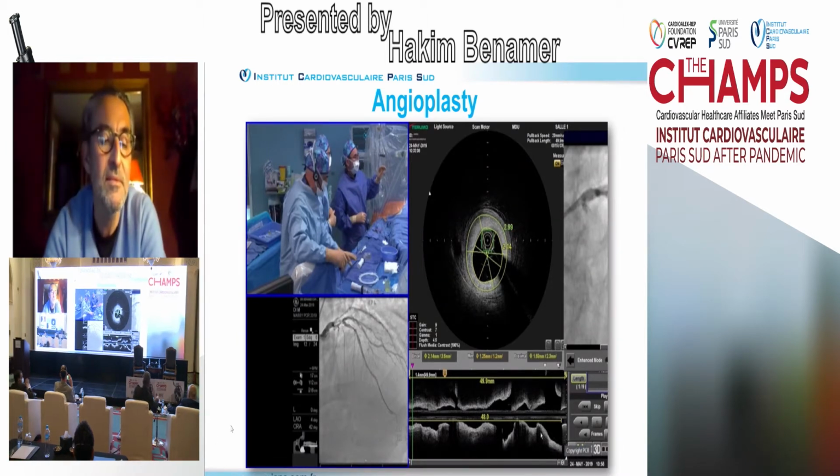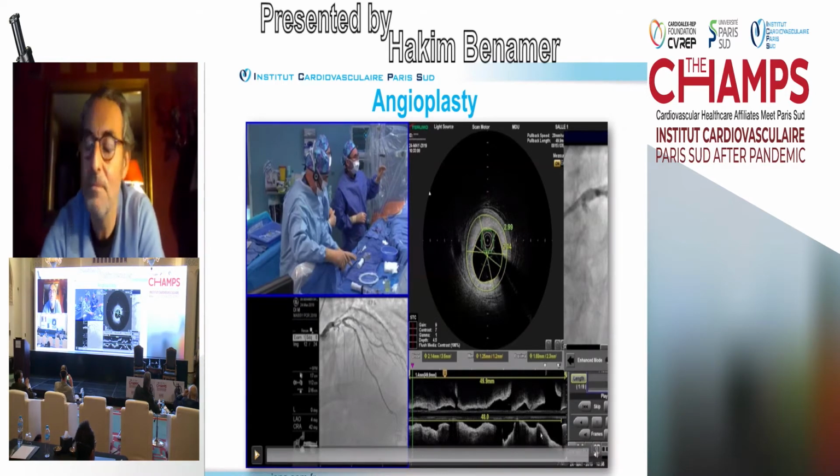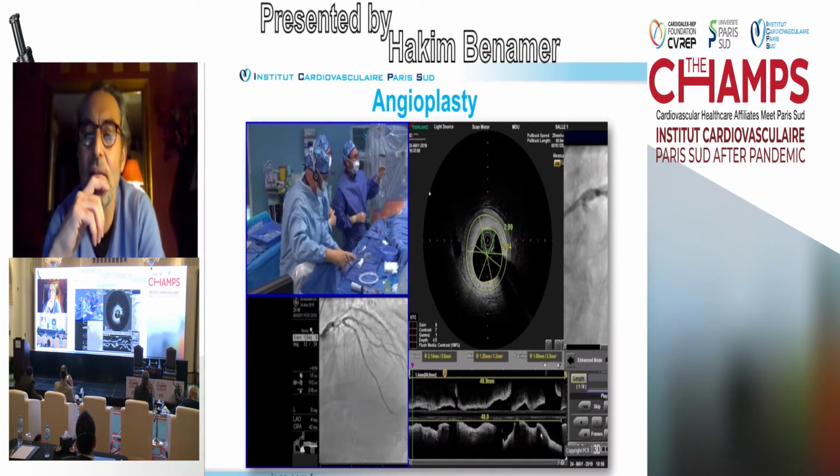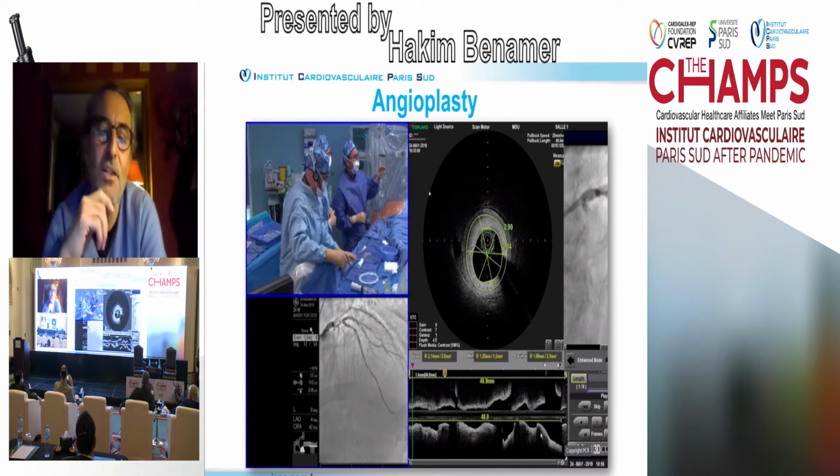Yeah, but you can't put the stent and adjust it to the ostium. You will cross over, of course. No, by Zabo technique, you can adjust only one strut in the left main. It will be sufficient for this lesion. So Dr. Khaled Chokri is suggesting spot stenting rather than crossover.